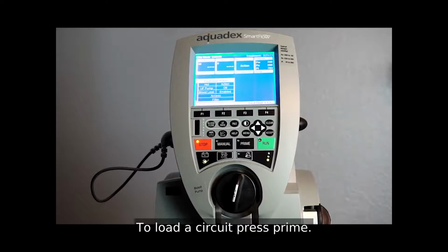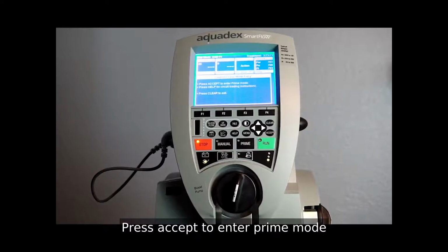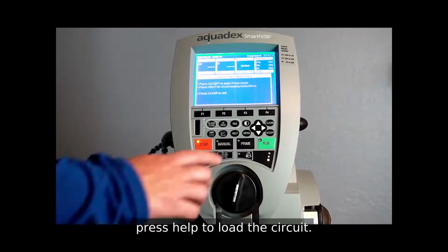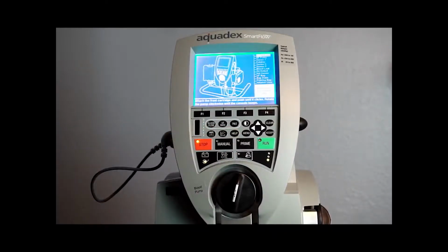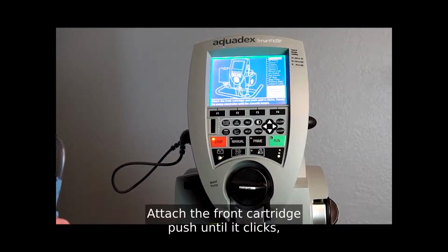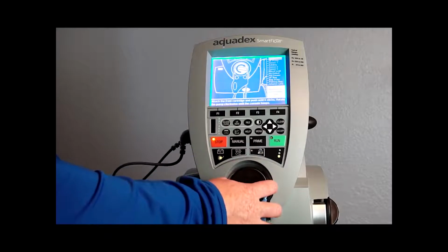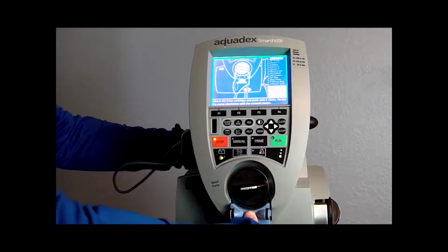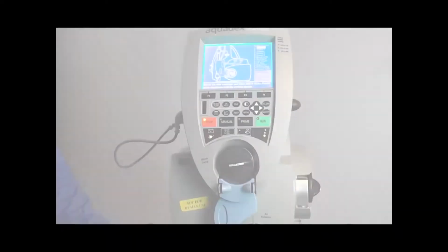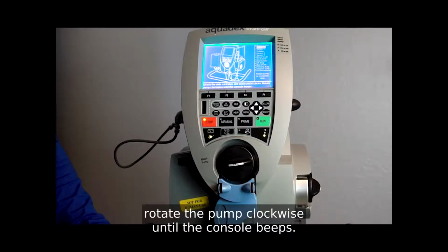To load a circuit, press Prime. Press Accept to enter Prime mode, or press Help for circuit loading instructions. Press Help to load the circuit. Attach the front cartridge, push until it clicks, rotate the pump clockwise until the console beeps. Attach the side cartridge, push until it clicks, rotate the pump clockwise until the console beeps.